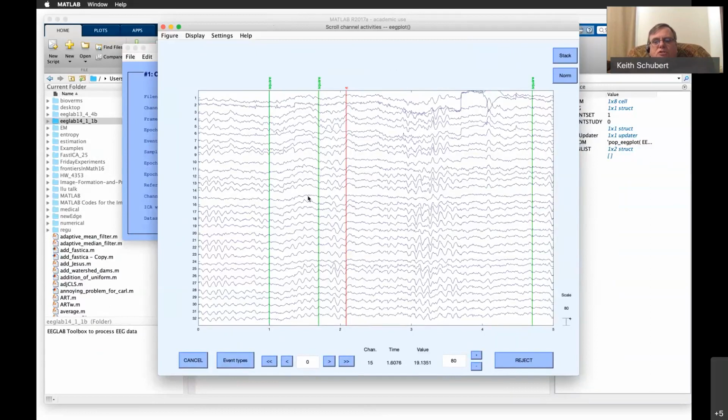And you can see that there's some characteristic activity, and they're trying to look at this and see, okay, what's the stuff that's handling the visual processing, the recognition, and then the motor planning to say, boom, go. Motor planning depends on whether the person was using left hand or right hand to push the button, right? Your right hand motor planning basically is in this area of your brain. For the left hand, it's usually here. So we should expect to see something go in here as an activity for that. Most of your visual processing is on the back part of your brain. So we should see something here and then some activities for the motor ones going on in between here.